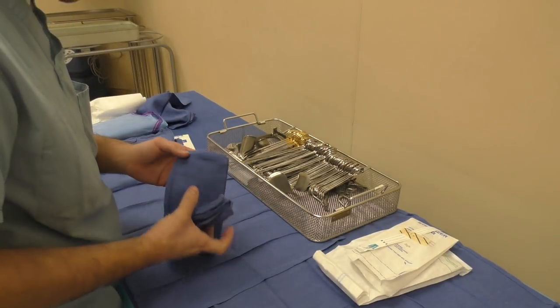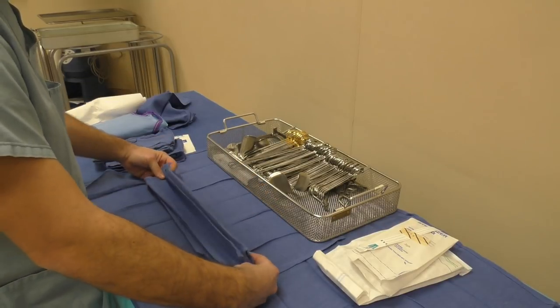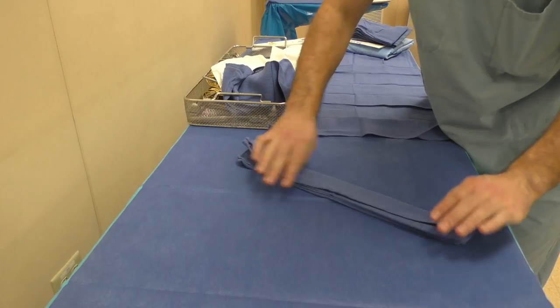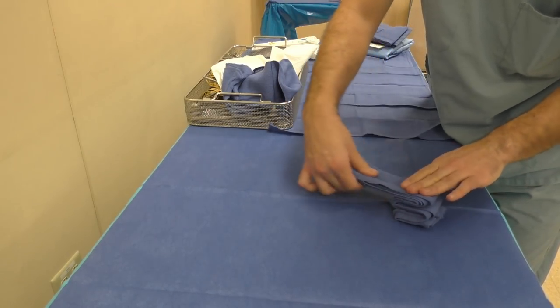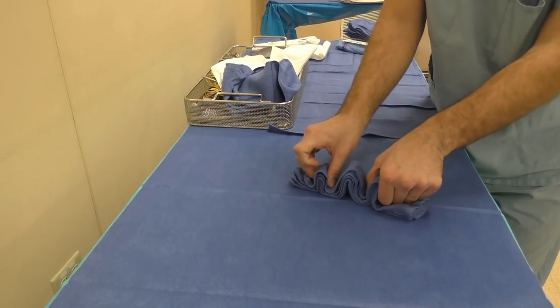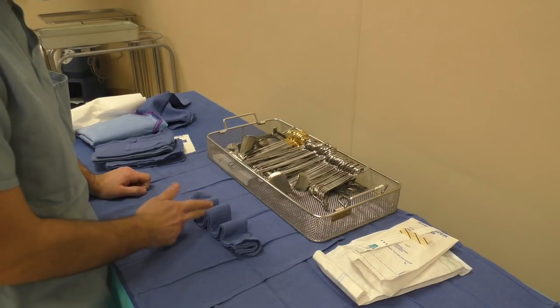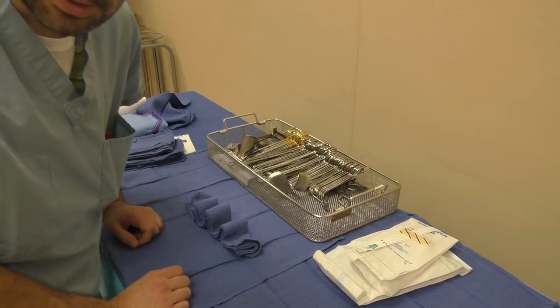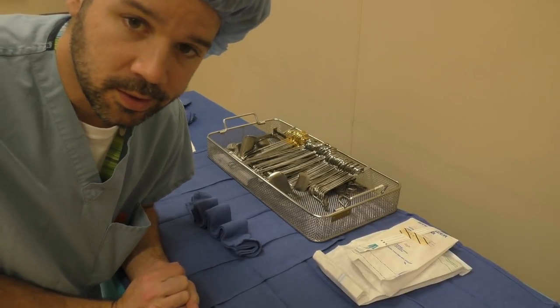The last instrument towel we're going to make is the inchworm. Basically you just fold the towel in and kind of fold it into itself to make a little inchworm shape, and you can place your instruments in between these little walls and it'll hold the instruments up. I personally don't use this but I know some people do, so I thought I'd include it.